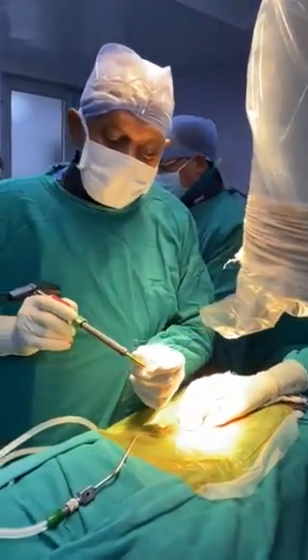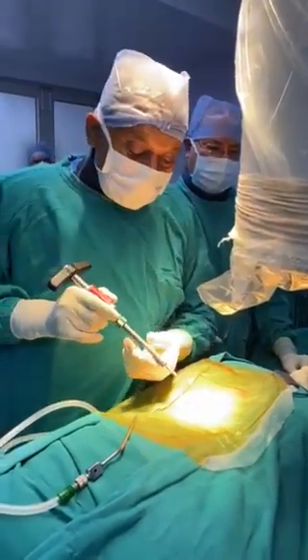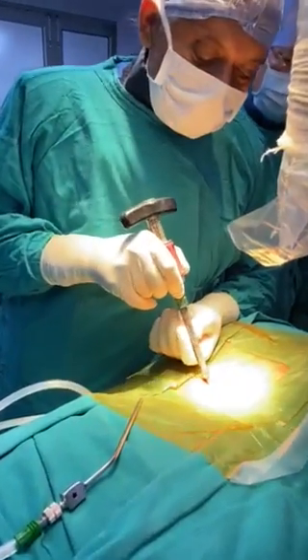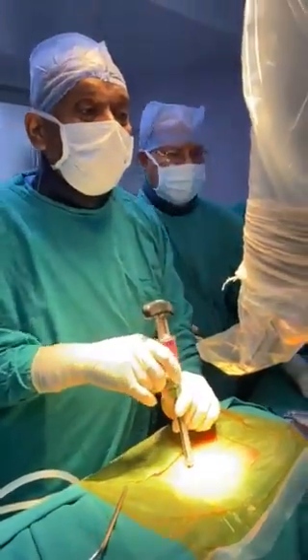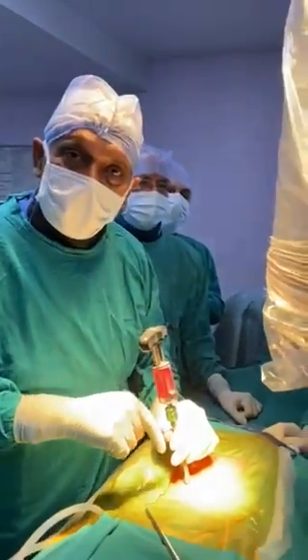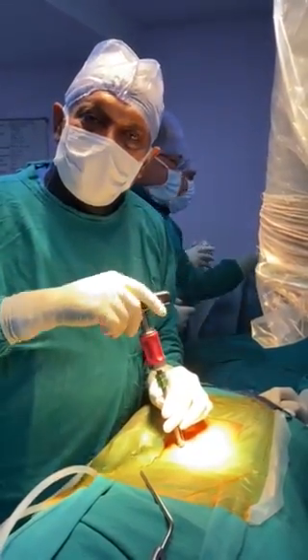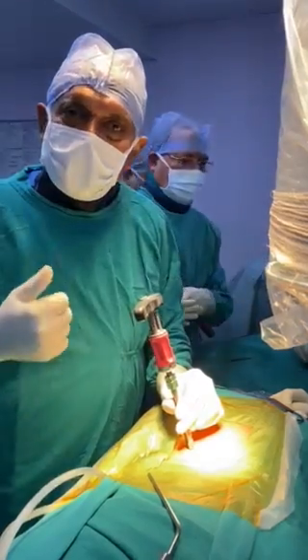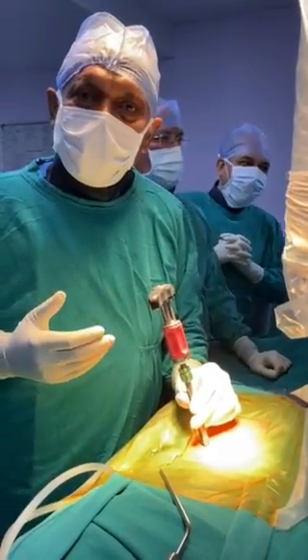This is a complete assembly. It has a K-wire in front, and I have given a stab incision and I am going straight down onto the pedicle, checking it on the C-arm. When I rotate this, the guide wire goes in, and I hammer it, then I put my screw inside. It's a very simple, straightforward, latest percutaneous pedicle screw system.